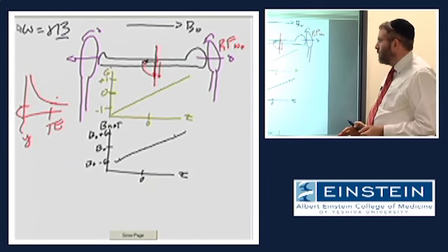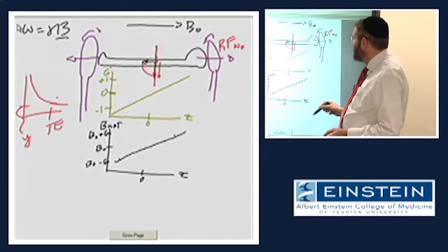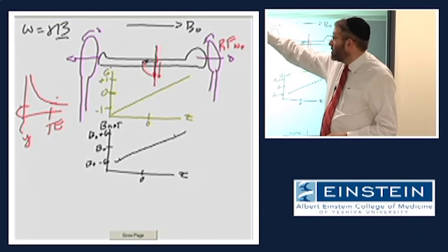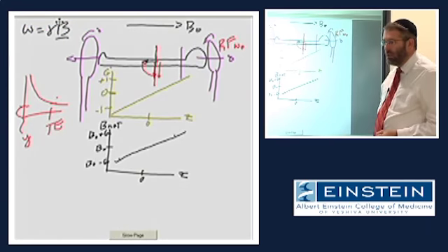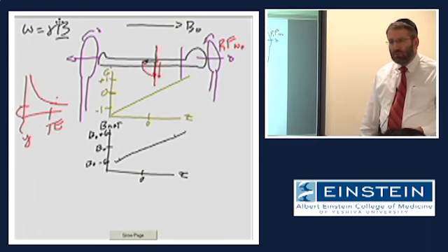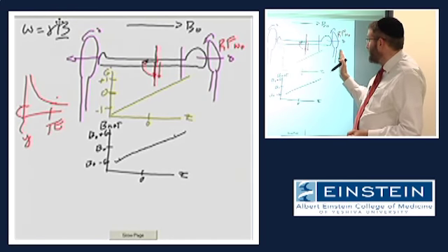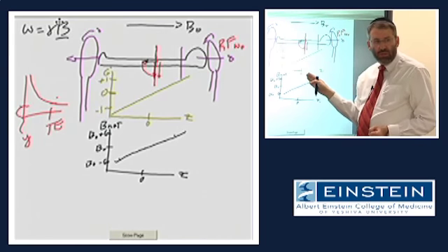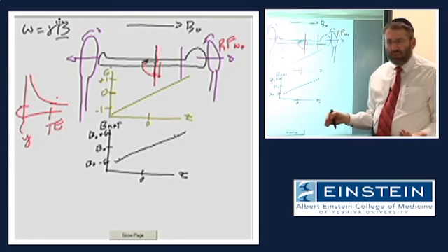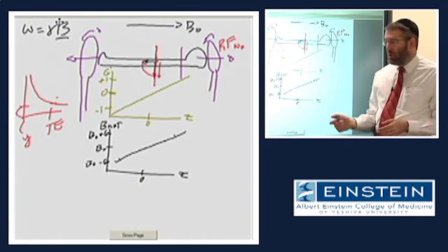So you might look at this and say, well, in that case, if I'm interested in imaging at some other location, let's say in the neck, what do I have to do? We could move the patient, right? So we could take the patient and slide him down so that his neck is at isocenter and do the same thing. Sounds kind of like a CT scanner. The patient just progressively moves through the scanner.